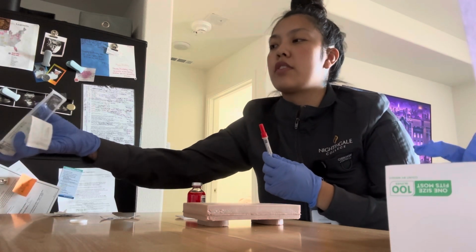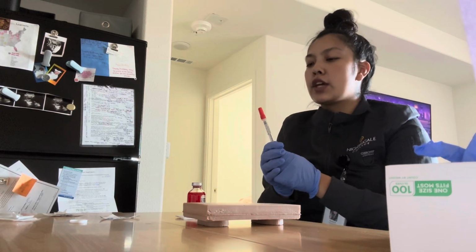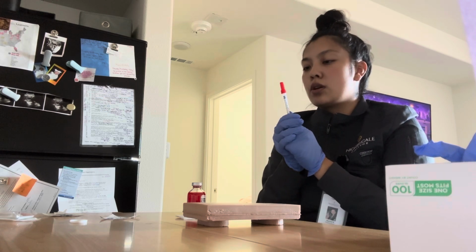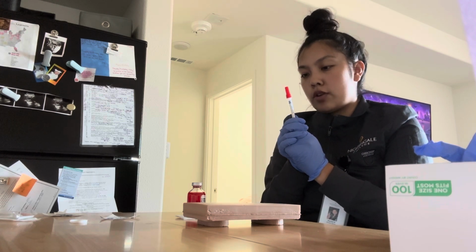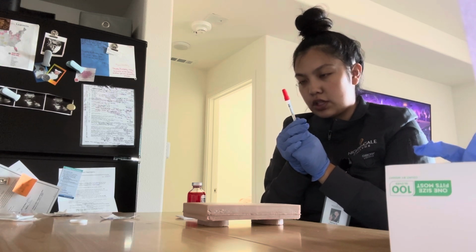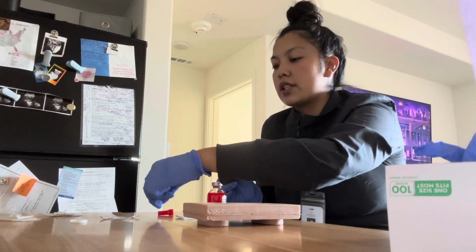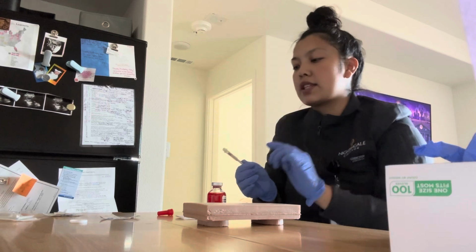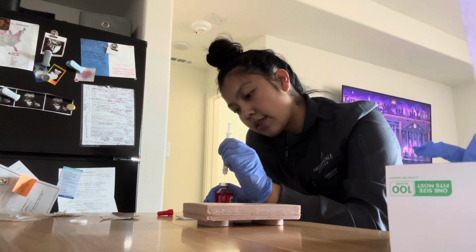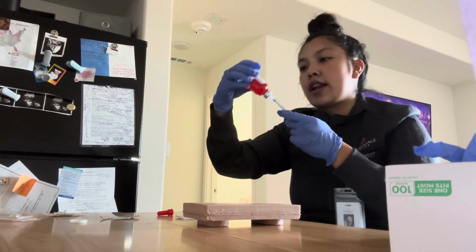I'm going to discard of it, but due to possible radiation, I'm going to go ahead and keep it. So first things first, I'm going to hold up the syringe like a pencil. Make sure that I read the order correctly. It's 0.1, so I'm just going to go ahead and pull down some air up until 0.1. I'm going to uncap. I'm going to leave the cap close nearby because I will be recapping. I'm going to go ahead and inject. Gonna go ahead and invert.